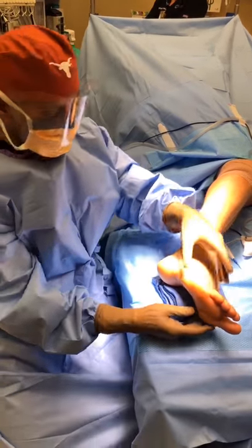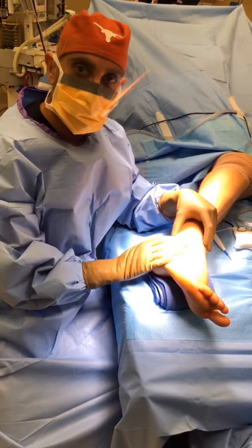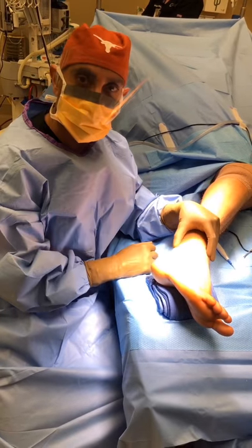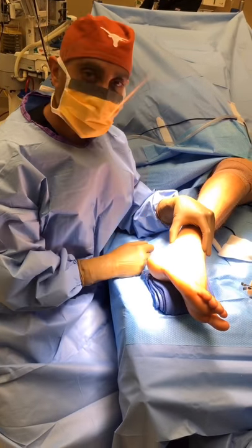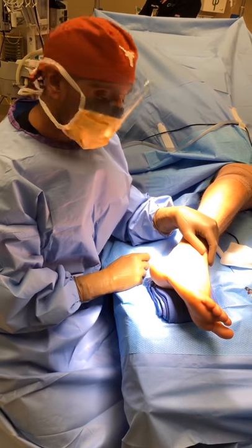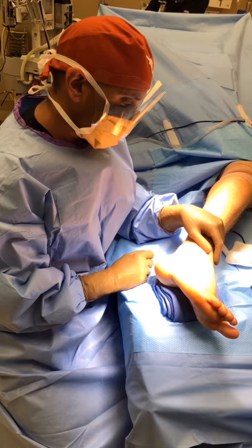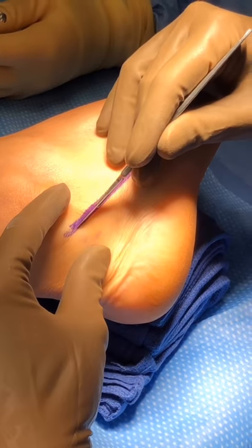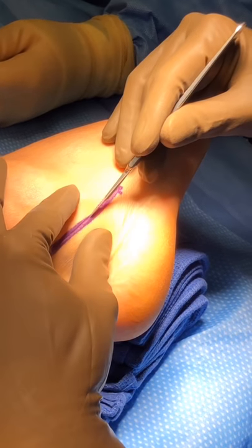He also has a very high arch foot, and so patients with high arch feet tend to have a lot of stress on these tendons, and tears and degeneration of those tendons are very common. So we're going to make an incision here, and we'll see what we see, and we'll take care of that. Okay. So we'll make an incision over the course of the peroneal tendons here.